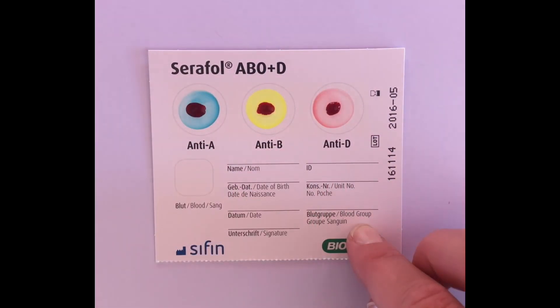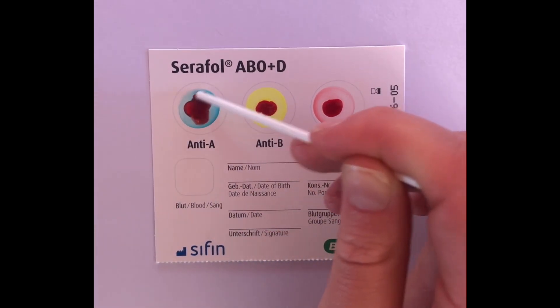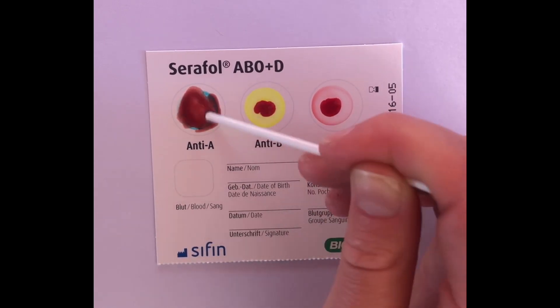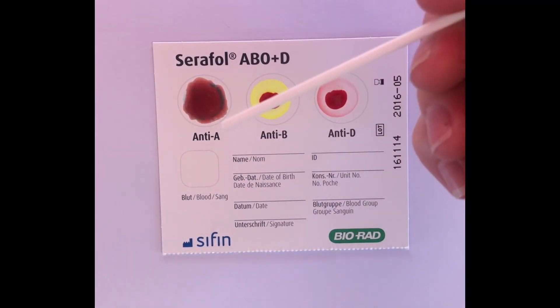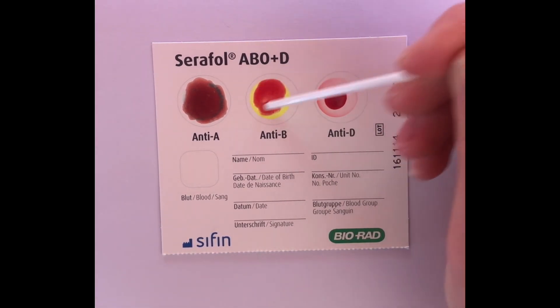Then add one drop of water to each reaction field. Using a mixing stick, mix each field for approximately 30 seconds until the reagent is completely dissolved. Use a new mixing stick for each reaction field, or carefully clean the mixing stick in order to avoid antibody spreading.